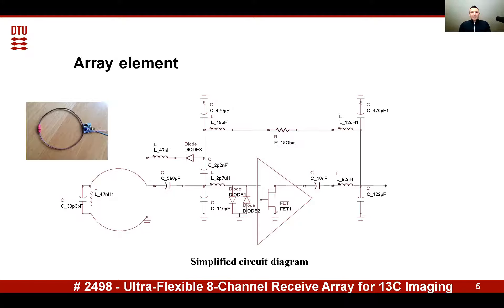You can see the protection diodes at the input and the active decoupling network. The coil loop is made of a flexible 1 millimeter diameter conductor. The diameter of the loop is 8 centimeters, chosen based on imaging considerations. To avoid interaction with hydrogen coils in the scanner, a parallel LC resonator is integrated in the loop.